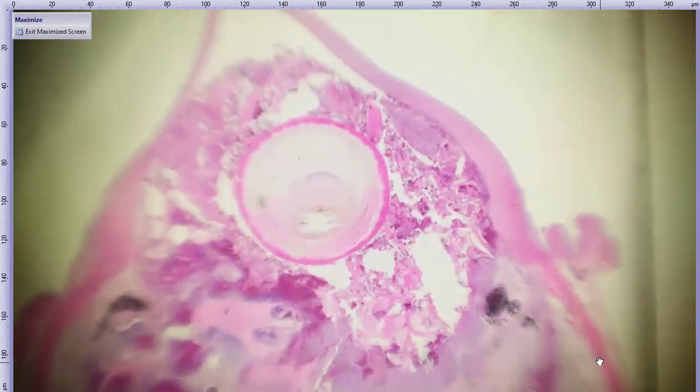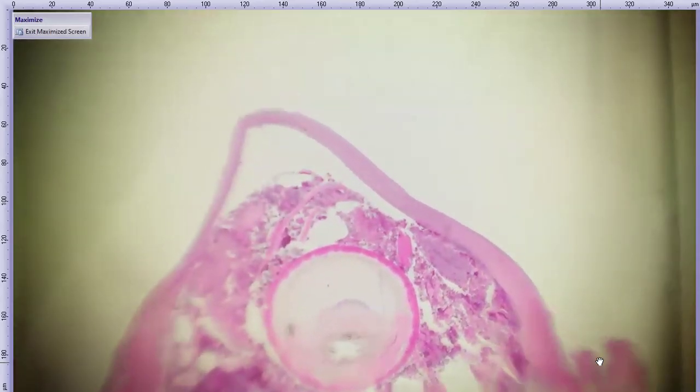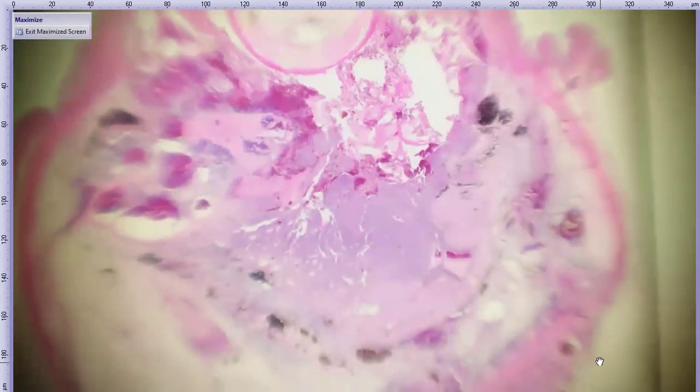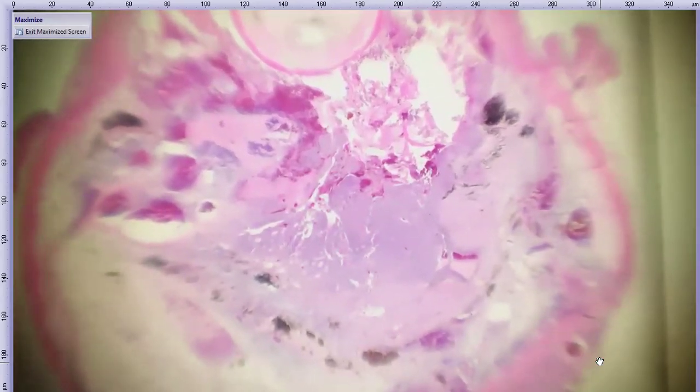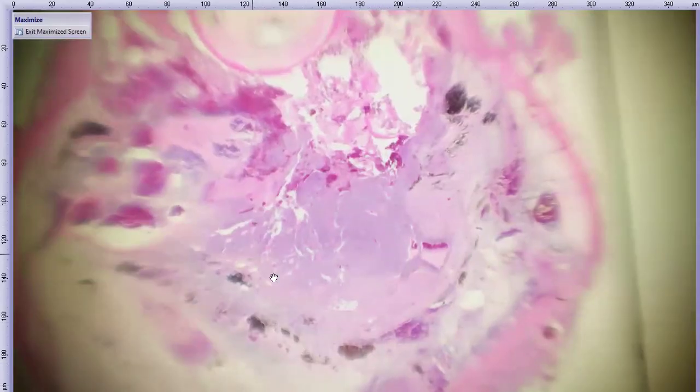Ooh. Yes, so heterogeneous. Here's the lens. Look at it. There it is. We do have a cornea. It's pretty thin and anteriorly bulging. And we have a bunch of like pink to purple tissue, so cells, blood, all sorts of chaos going on here. And then in particular, an area of interest is sitting right here in kind of like vitreal space or so, with all of this purple where there are cells.